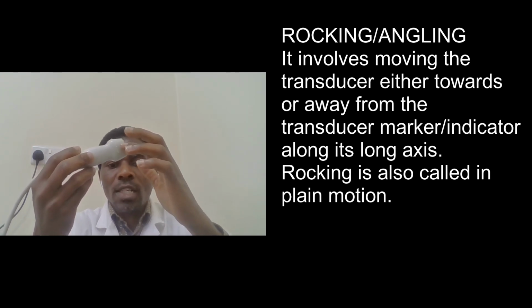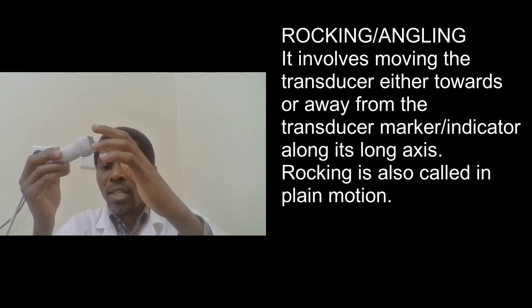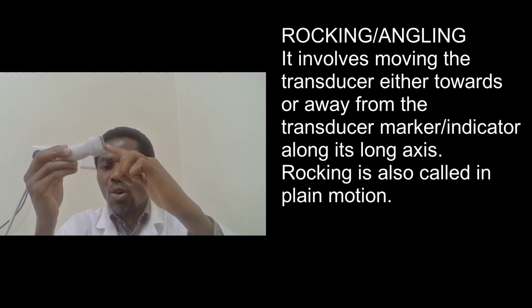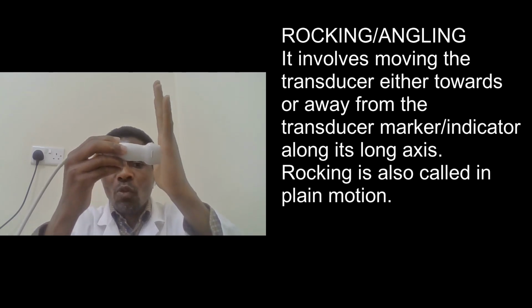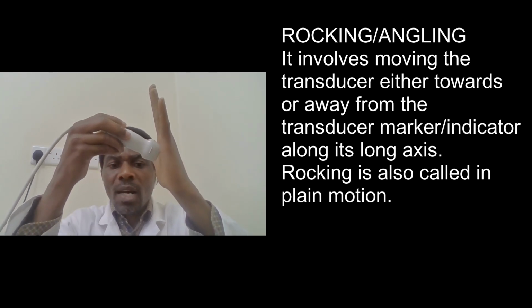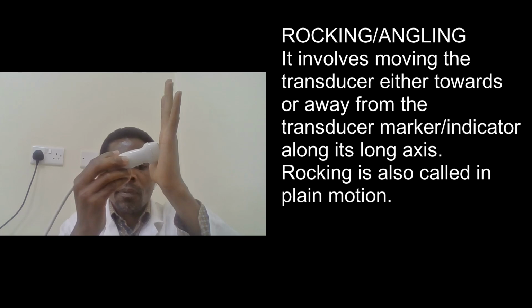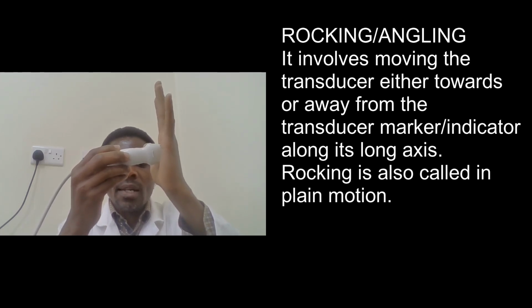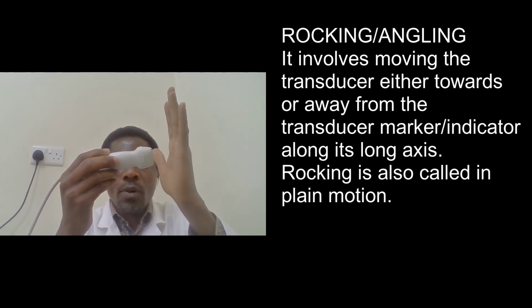So this is the short axis, and this one is the long axis. So when rocking, you move it towards the marker or away from the marker. This movement can help us to center the area of interest.